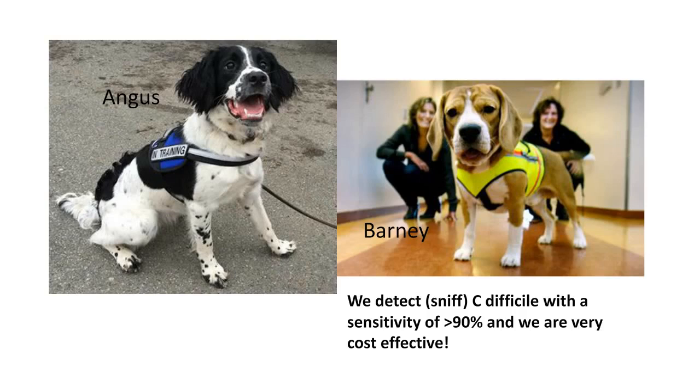That's okay, Dr. Morgan. Thank you. But I know that as time moves forward, of course, reimbursement will be an issue for all of us. We do have so few toxins done. The EIA toxin A and B is done in comparison to the numbers of PCR assays run, that our primary billing test is PCR. But we're developing a battery to bill the EIA test. But as of right now, our primary billable test is PCR because that is by far our screening test.